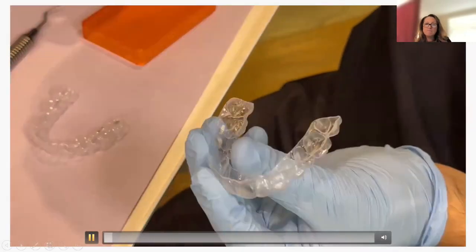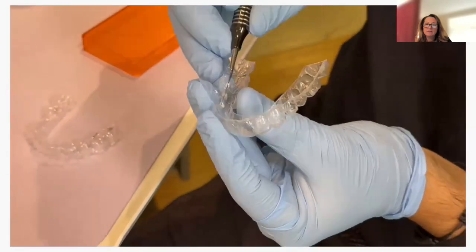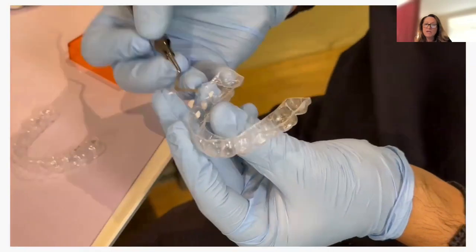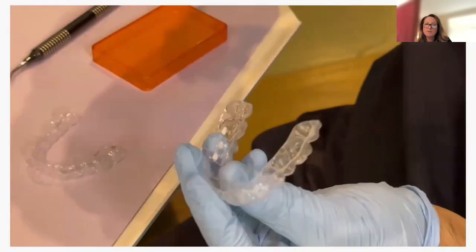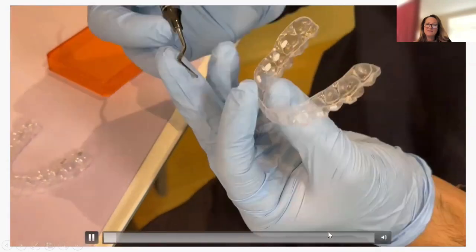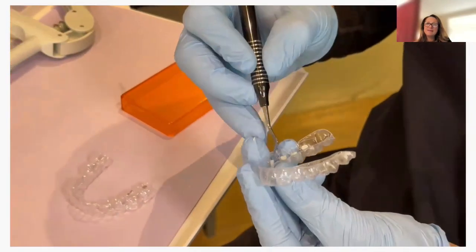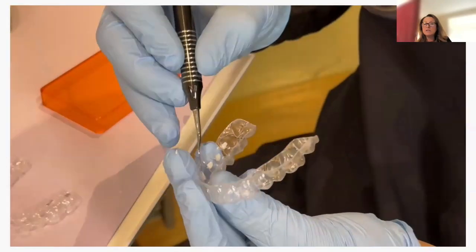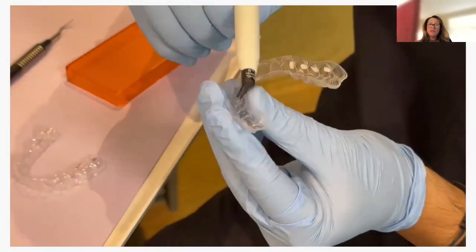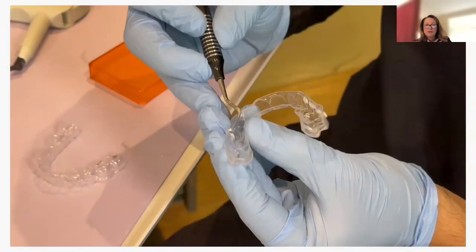So he's packing it in. And, you know, whatever kind of instrument that you want to use. Since it's the assistant and the doctor, they're going to fill all the attachments and do this in one sitting.